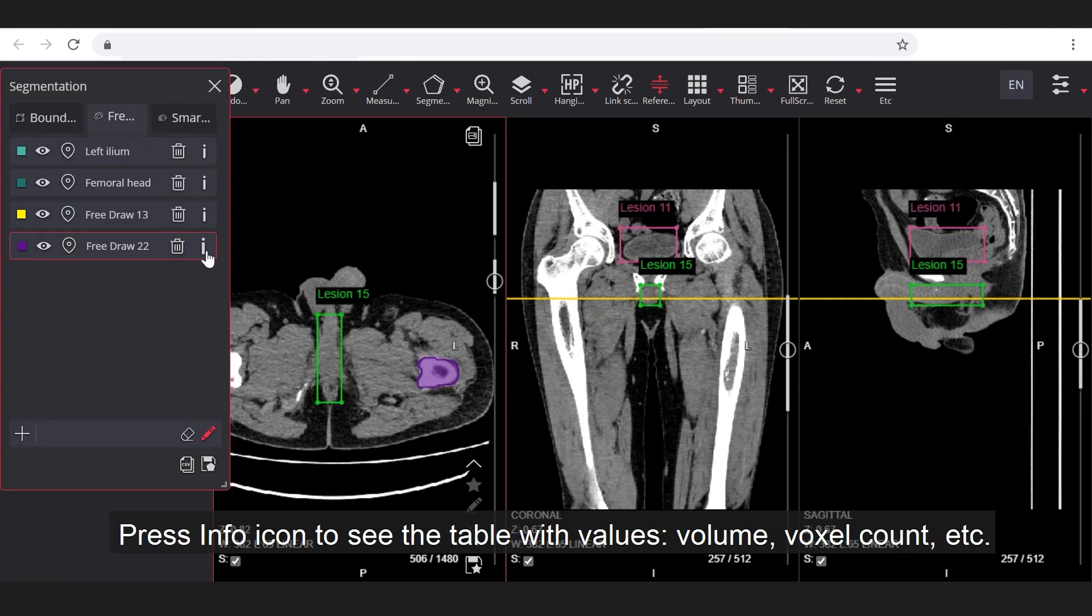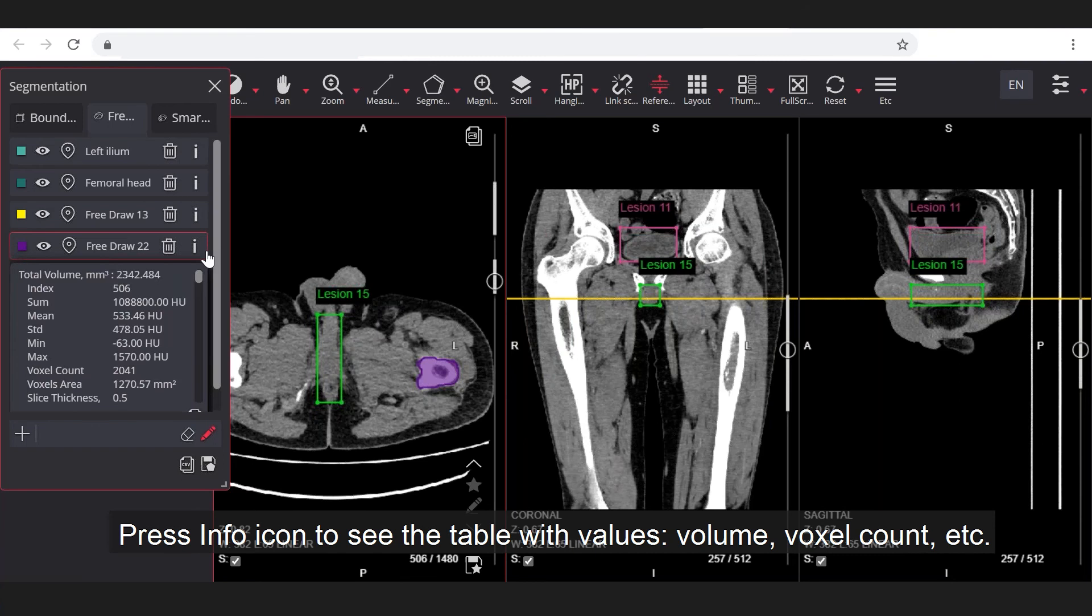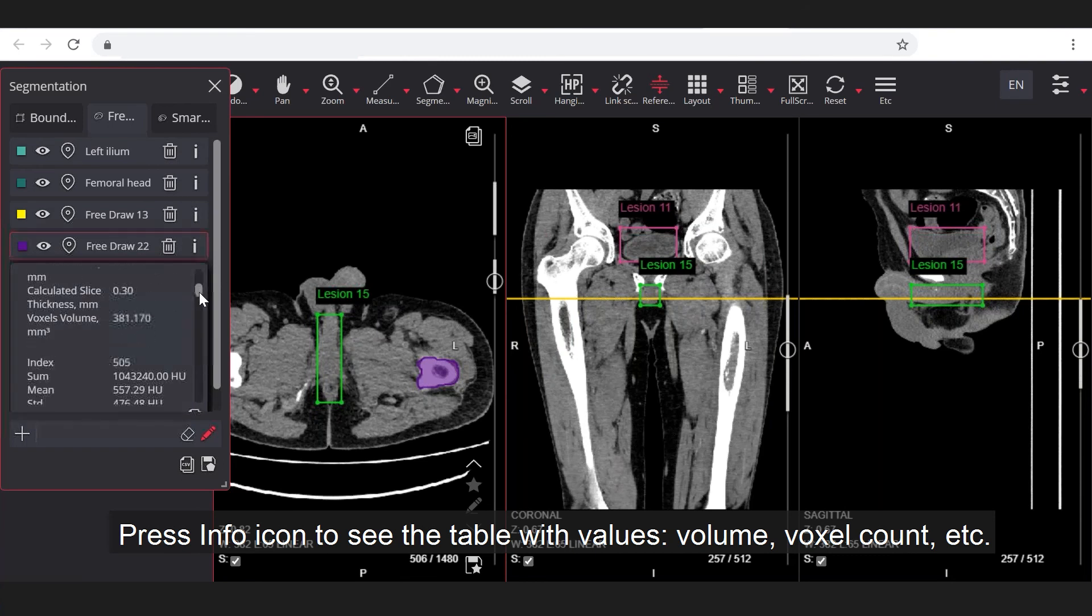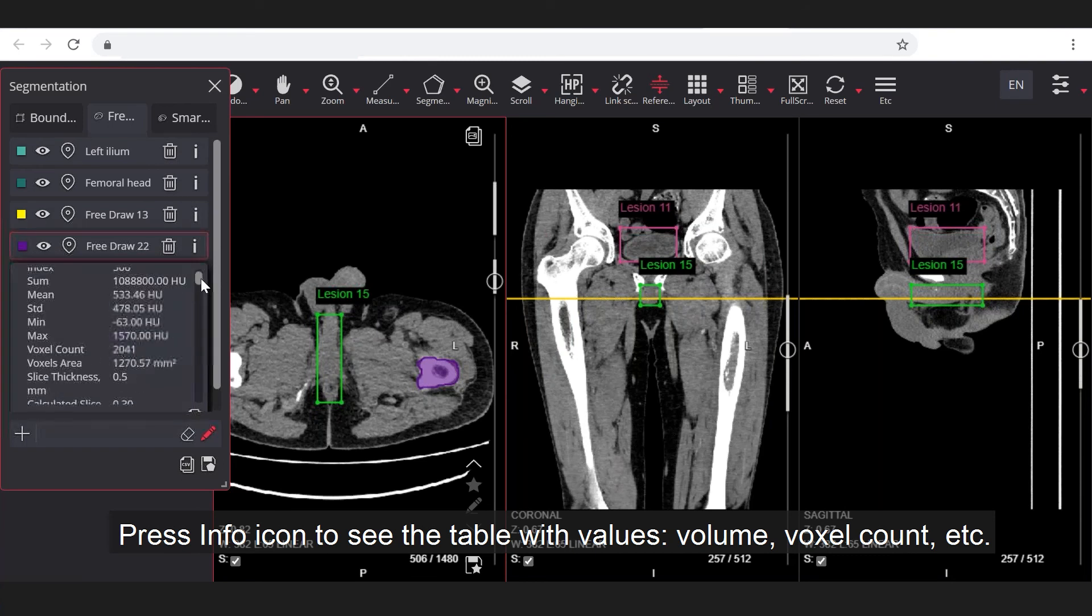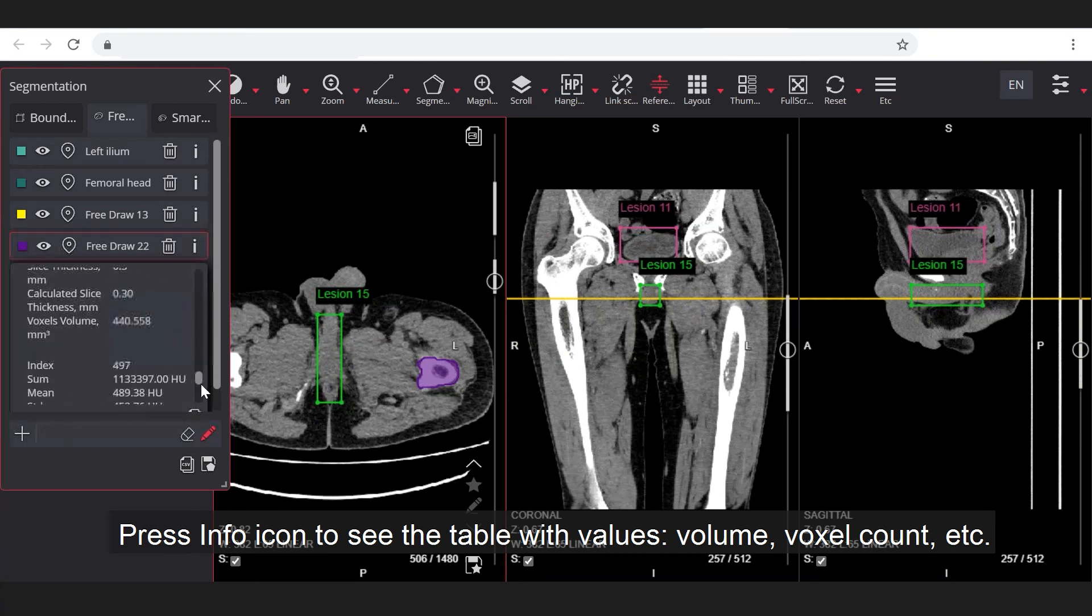Press info icon to see the table with values: volume, voxel count, etc.